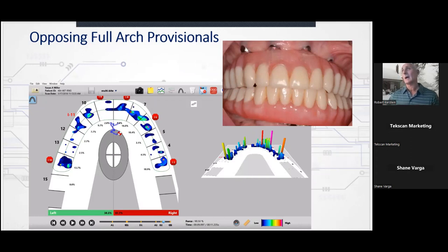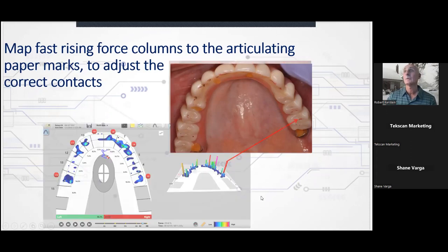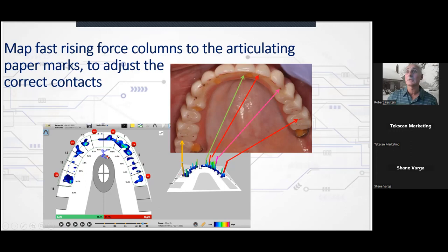So she's actually stopped from biting, and there are 6 implants under overload. And this arch is matched to her, right? Now, how do we use that information? The same way we just talked about, right? Finding the orientation of the high force zones and the moderate force zones based on the anatomy. For example, that one's in the middle of the central incisor. There it is in the middle of the central incisor. This one is the most distal buccal contact you can find. That's the most distal buccal contact you can find. There it is. This one is more mesial in the lateral incisor.